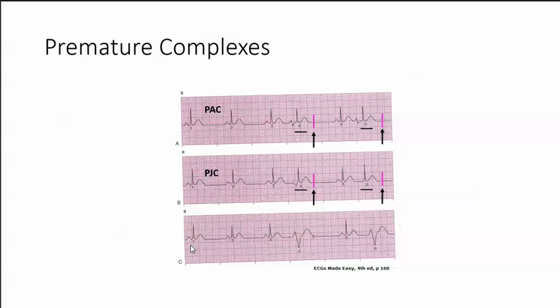The last one: all these are normal. This one is odd and this one is odd. It has a wide QRS; the T is in the opposite direction from the QRS, has no P, no PRI. The next beat after this one should have happened here, and the next beat after number five should have happened right here. So you have a premature beat with a wide QRS and no P. This is a premature ventricular complex.